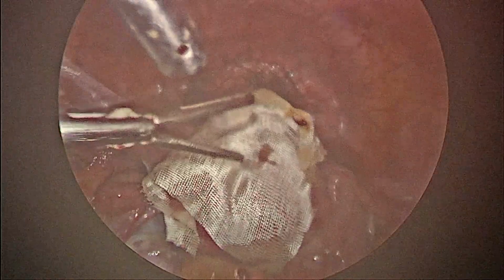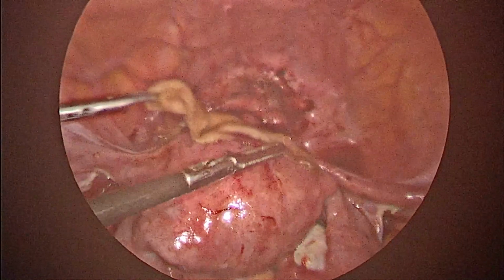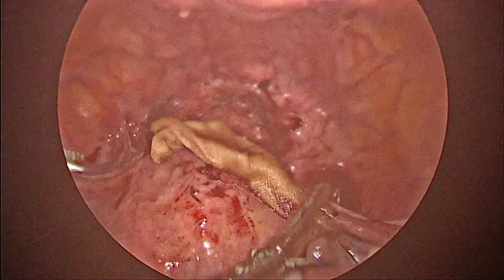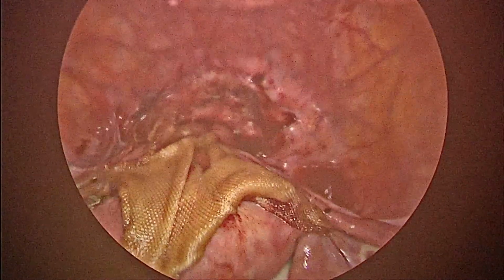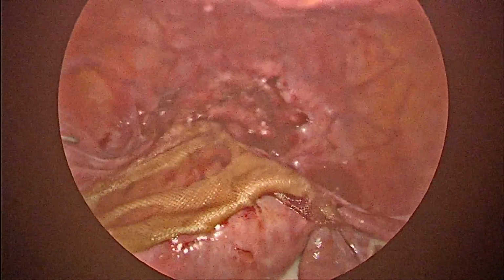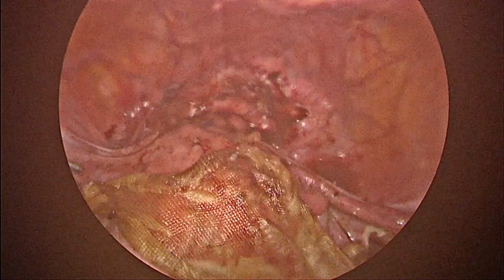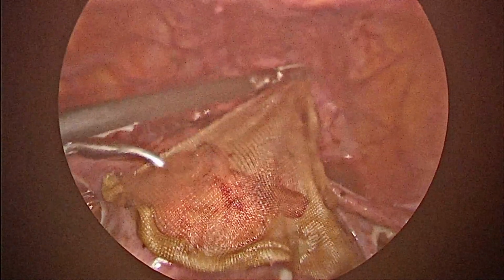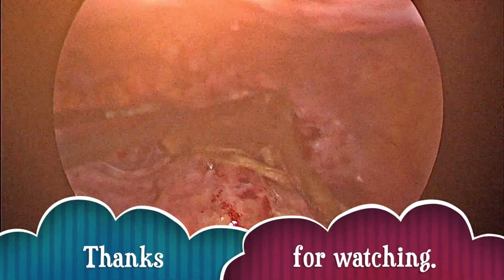Interceed, that is oxidized cellulose, is used to cover the suturing site to prevent adhesion formation. So this is the complete procedure of scar pregnancy management.